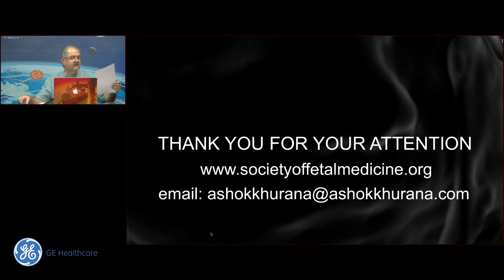We really have a charming number of questions, and I'll go through these. And there's a nice question here. What are the causes of persistent unilateral echogenic contracted kidney with loss of corticomedullary differentiation with small subcapsular cysts? Other kidneys absolutely normal, no associated abnormalities. I showed you an example of bilateral kidneys that were like this.